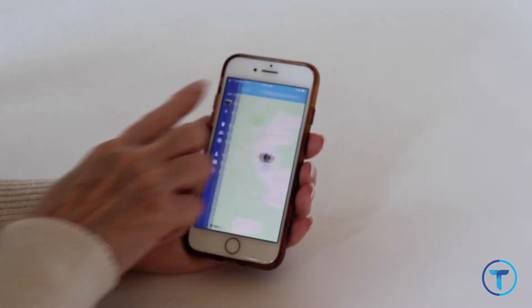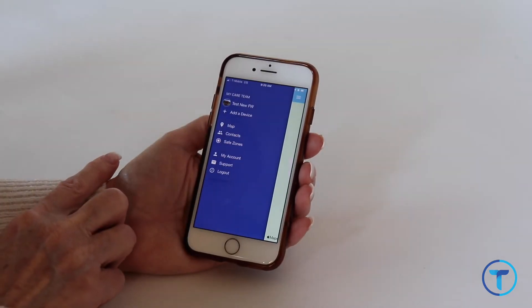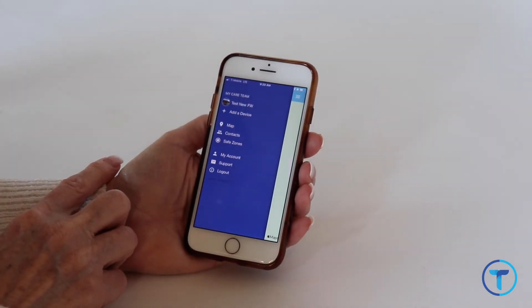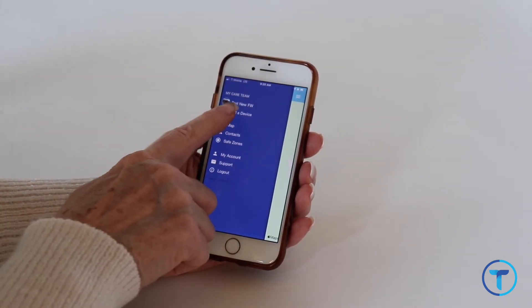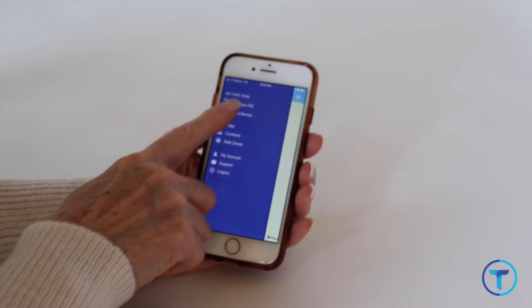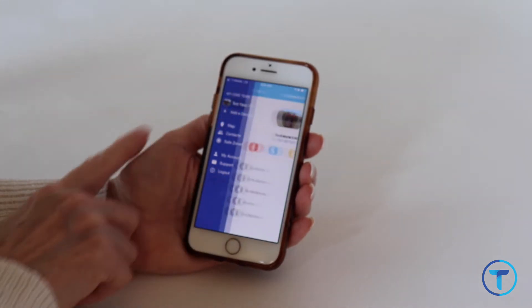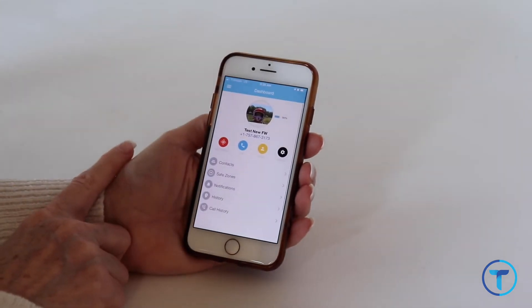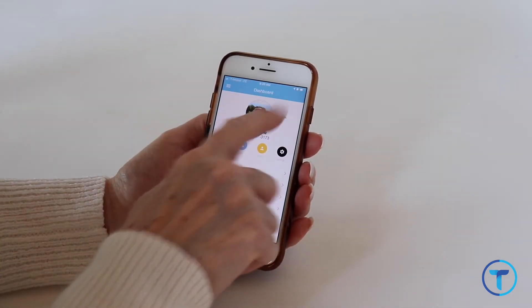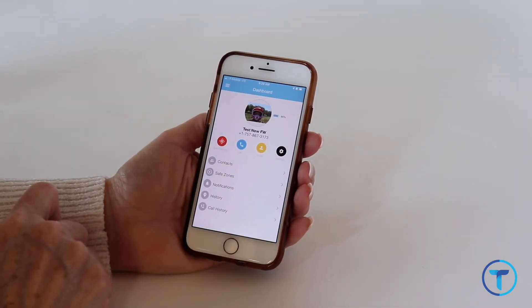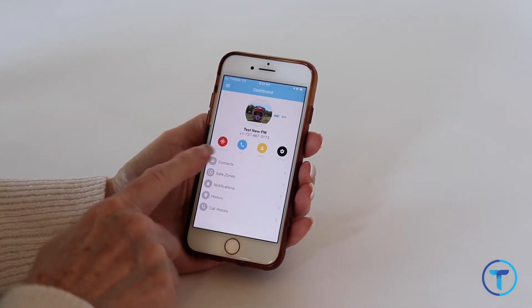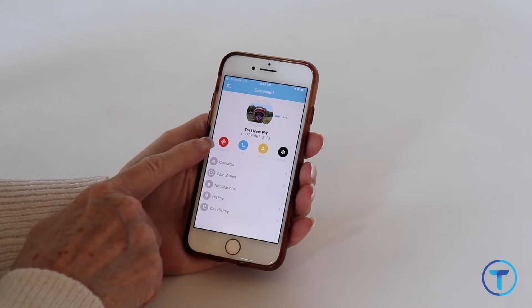To expand the menu, click the three lines in the upper left hand corner. This shows my care team. Your device or multiple devices are listed below. Click on a device to see the device's dashboard.